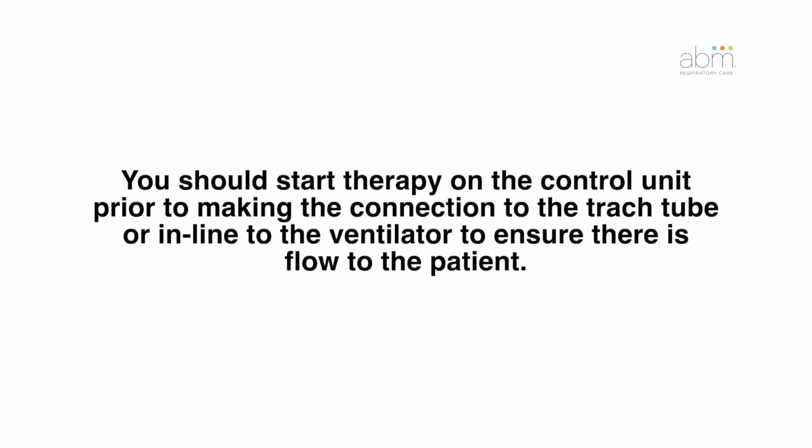Note: you should start therapy on the control unit prior to making the connection to the trach tube or in line to the ventilator to ensure there is flow to the patient.